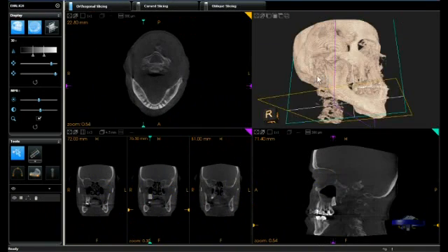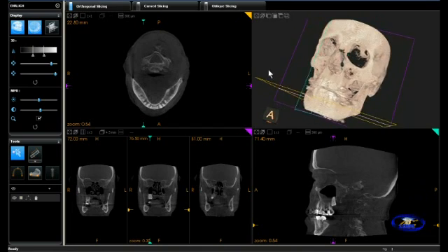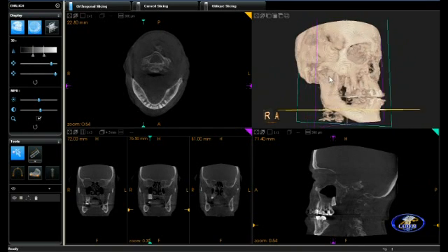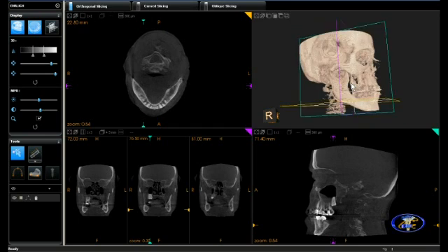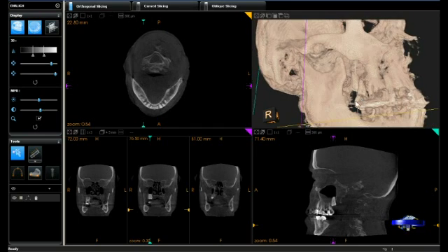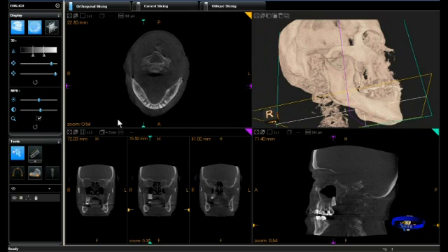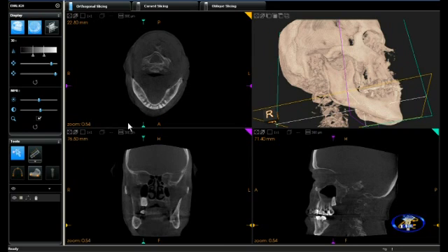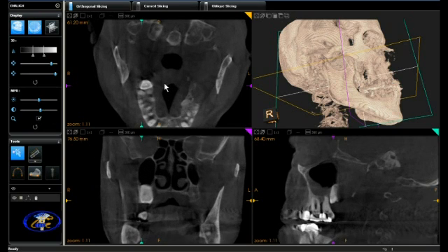This full field DICOM volume was acquired with the Kodak 9500 cone beam CT unit. In the upper right we can see a 3D volumetric representation of the impacted upper right third molar — it's a vertical impaction — and we want to be able to visualize it clearly in all three dimensions. Viewing the upper left panel, we'll zoom in a little bit.